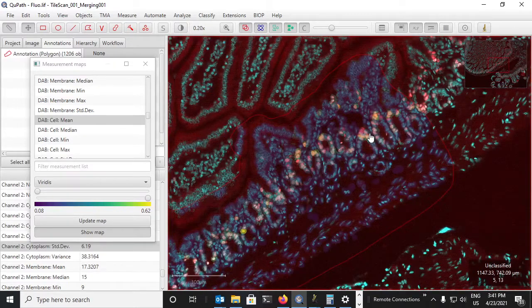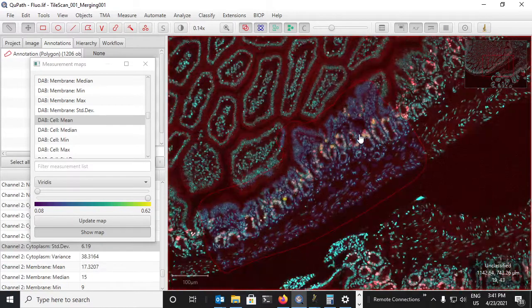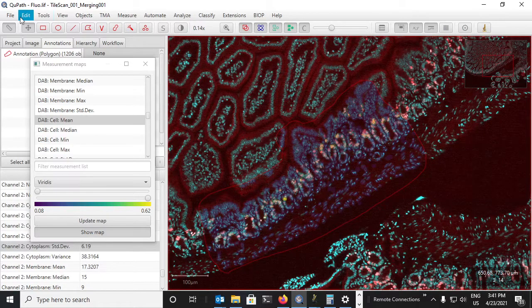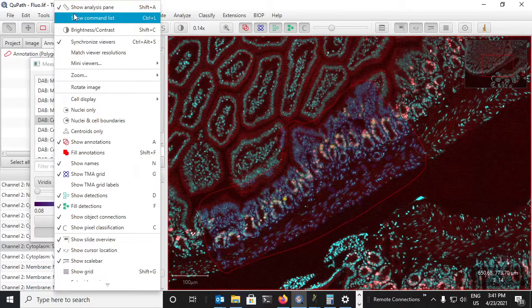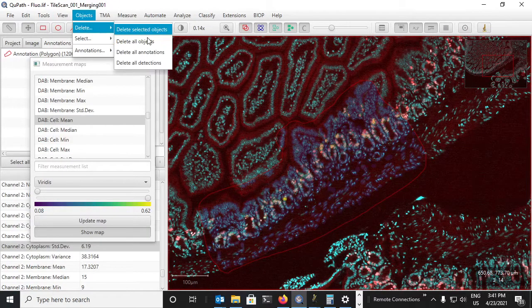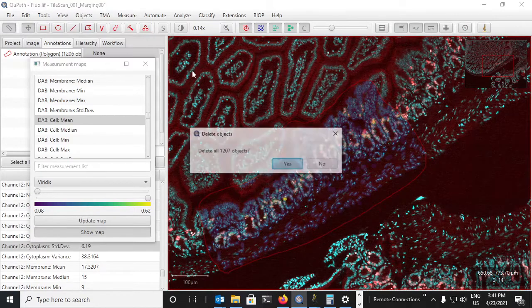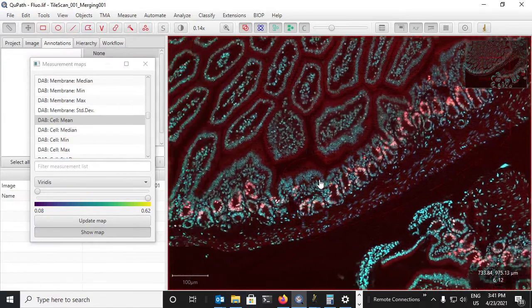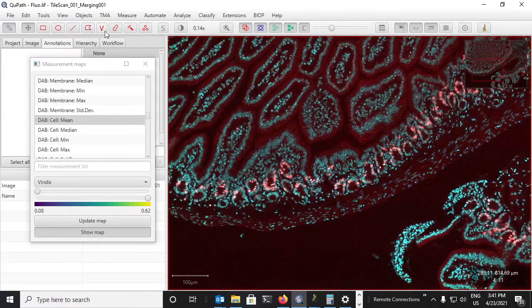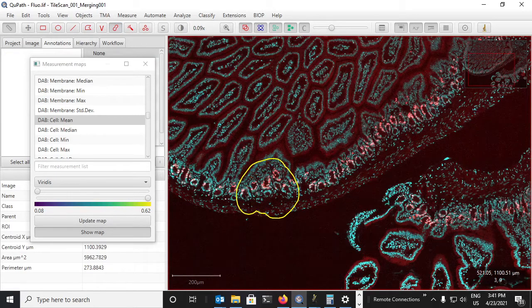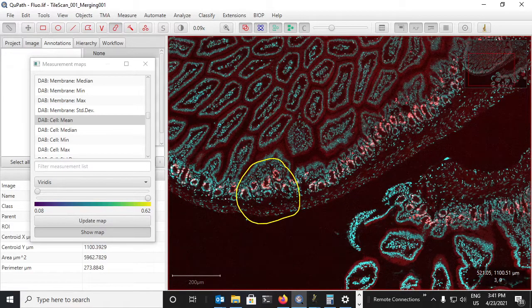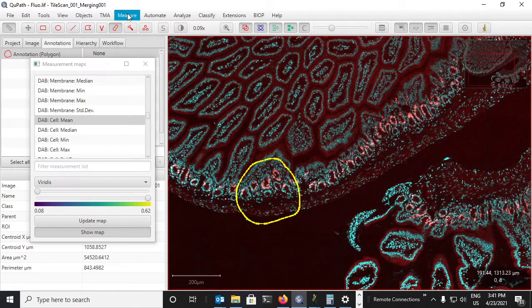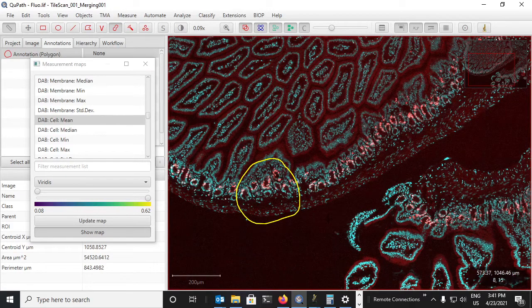Now we can also do this backwards, meaning I can delete all the objects on this image and draw out another region to analyze, let's say this one, for which I will also run a cell detection.